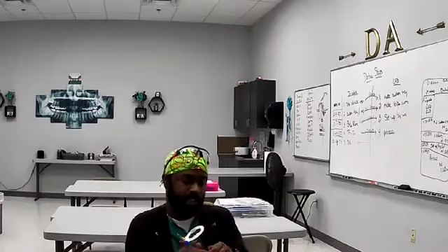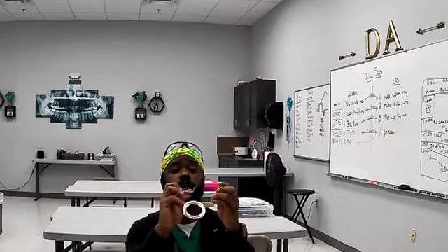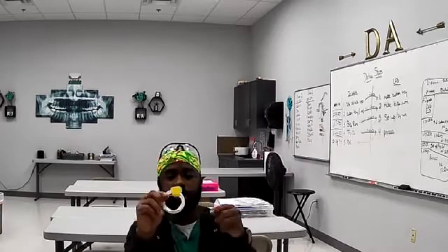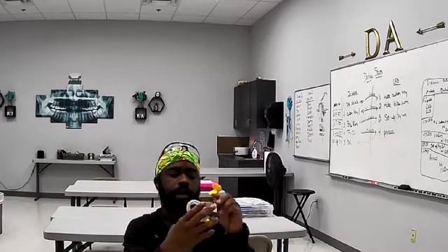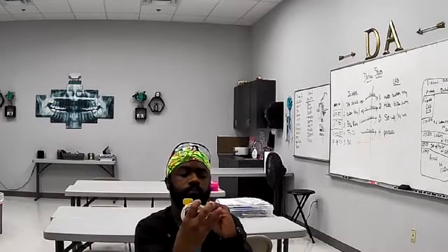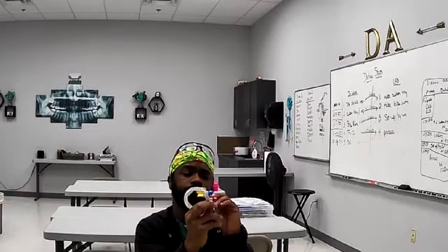And same thing, if I was to say take a PA of number 30, it would literally be the same thing. You would go ahead and put your sensor holder on first, and then you align. Line it up, go straight there.